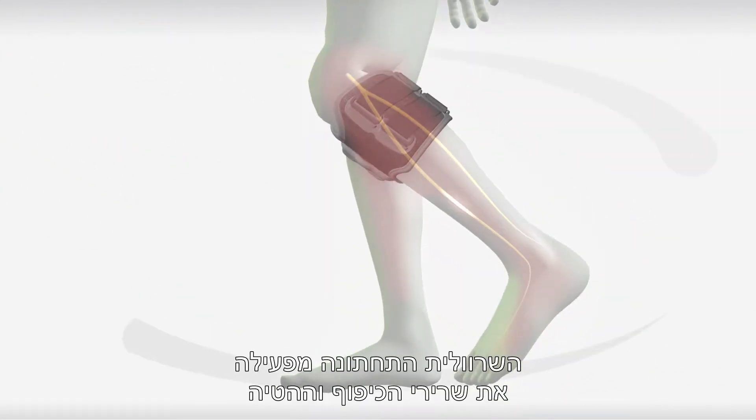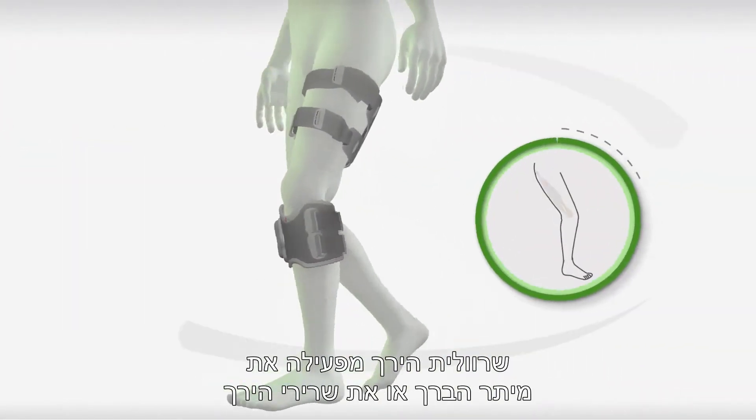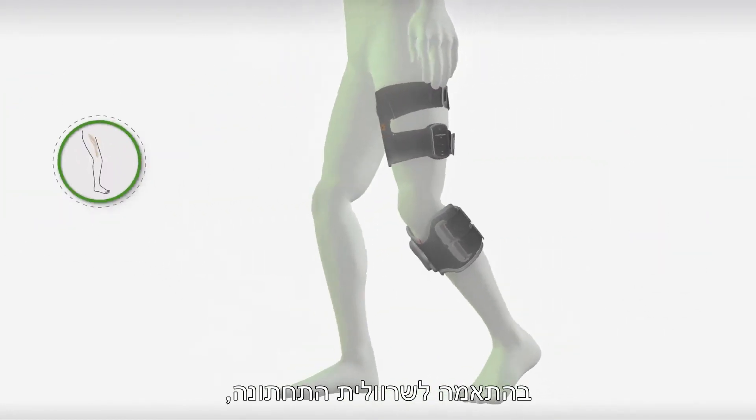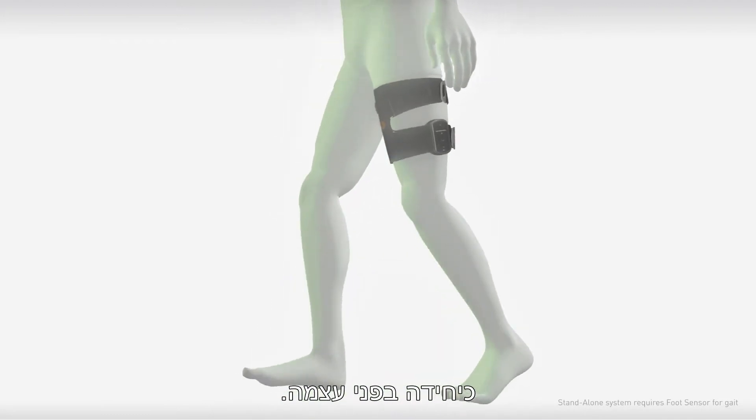The lower cuff activates the dorsiflexors and evertors, which enables foot clearance during swing. The thigh cuff activates either the hamstrings or quadriceps working in tandem with the lower cuff, or new for L300GO, as a standalone system.